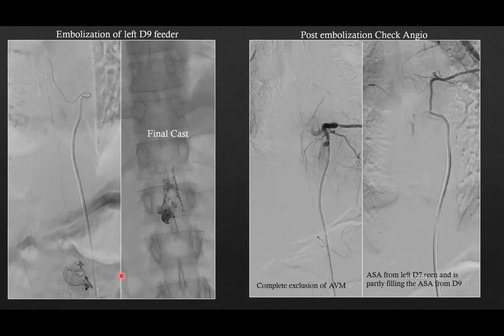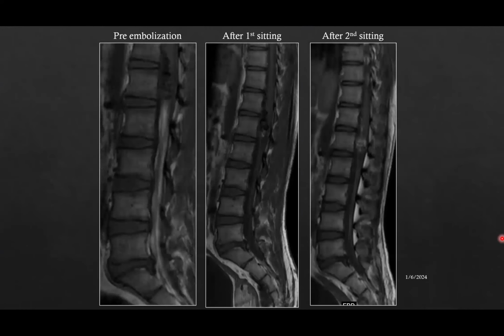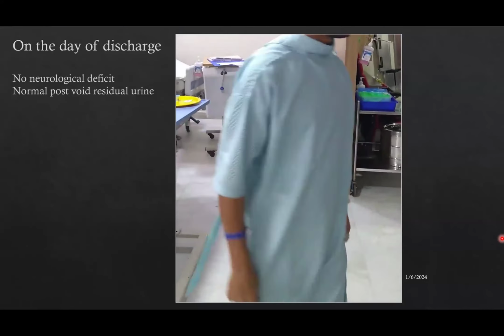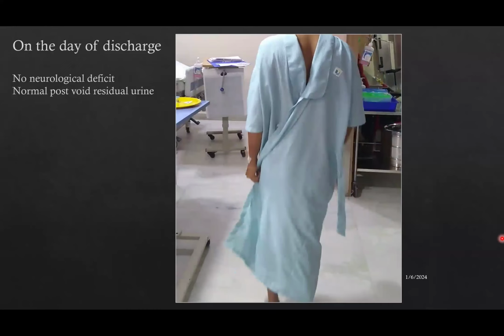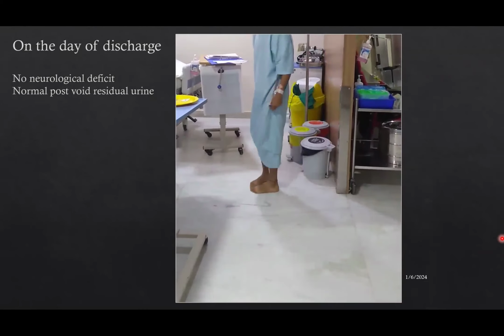So this is the follow-up MRI. If you can see, pre-embolization, after the first sitting of embolization, there are reduced vascular flow voids, and this is after the second sitting of embolization, again showing the resolution of the subarachnoid hemorrhage after the procedure. And this is the patient after the second sitting of embolization. There was no significant neurological deficit. His bladder and bowel functions were also preserved.